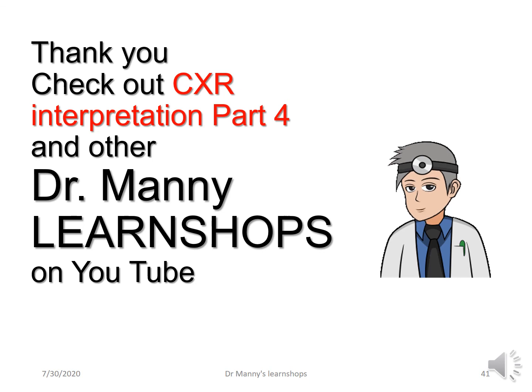So this is the end of chest interpretation part 3. If you've enjoyed it, I hope I'll see you partaking in part 4, which deals with cardiac anomalies on chest x-ray.